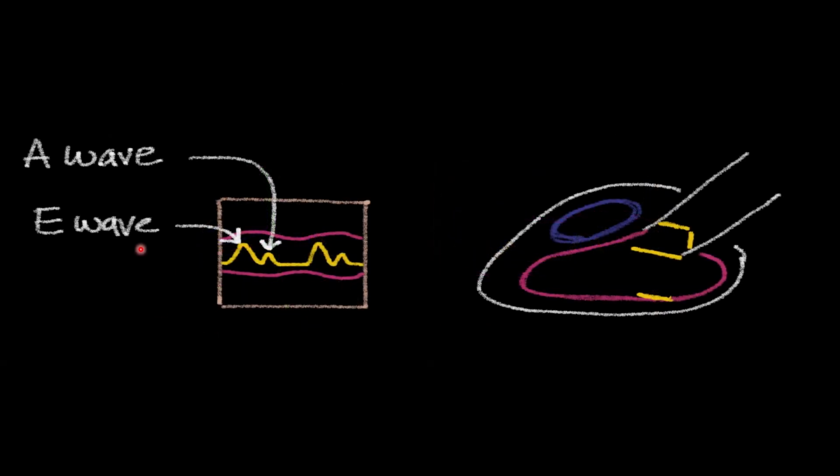It's important to remember that you're measuring the first wave, which is the E wave, or the early wave, as opposed to the A wave, which is the atrial kick as seen here. So again, EPSS is E-point septal separation.